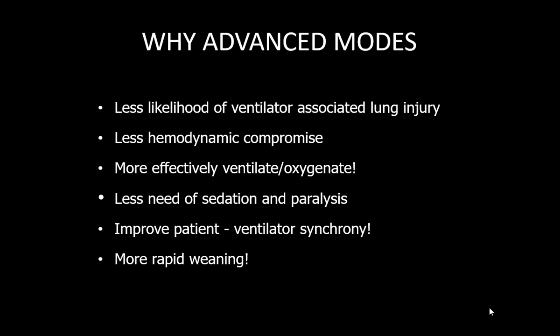Less likelihood of ventilator associated lung injury, less hemodynamic compromise, more effectively ventilate or oxygenate the patient, less need of sedation and paralysis. It improves patient ventilator synchrony and more rapid weaning. So these are the parameters of any ideal ventilation.